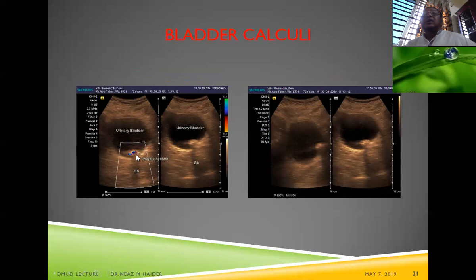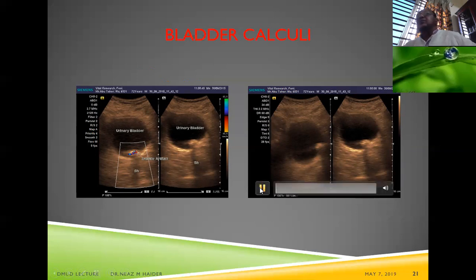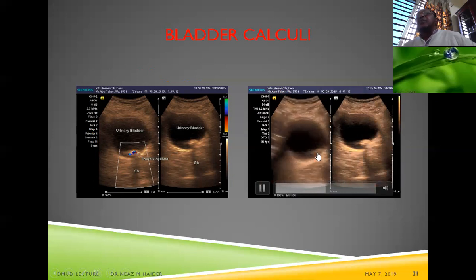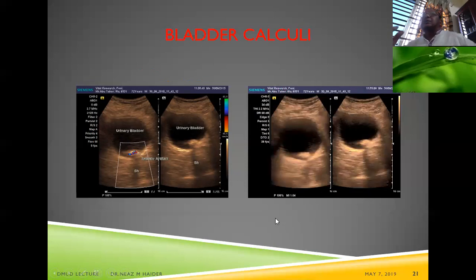A calculus moves with posture change of the patient. On color Doppler, a color comet-tail artifact or twinkle artifact is produced, which increases diagnostic confidence. The movement of the calculus and its posterior acoustic shadowing — both moving together — confirm it as a calculus.